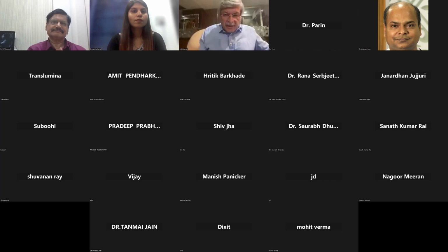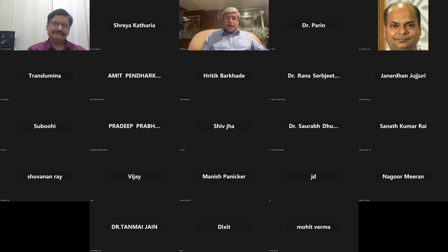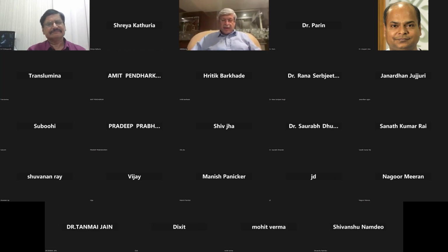No, I think I agree with you entirely. I think this was an excellent presentation of a good case done with IVL, and it also highlights the importance of judging the calcium before the procedure, and aiming for good plaque modification before stent deployment. It's not a very long lesion, balloon crossable, straight segment, and I think a very good case for an IVL.